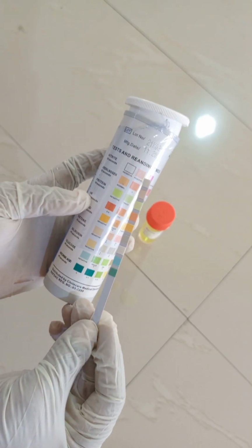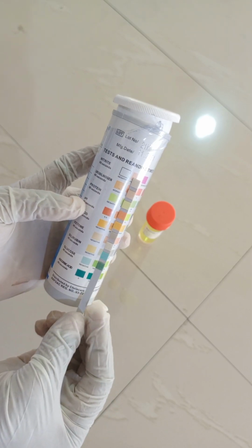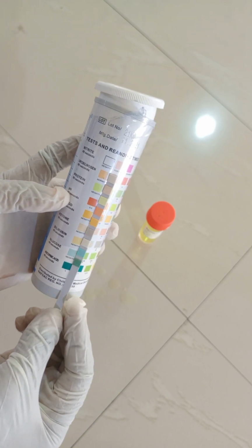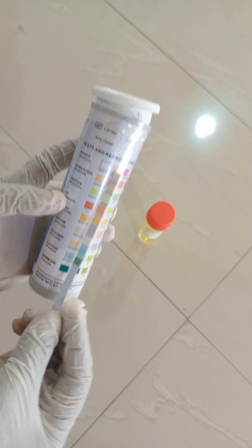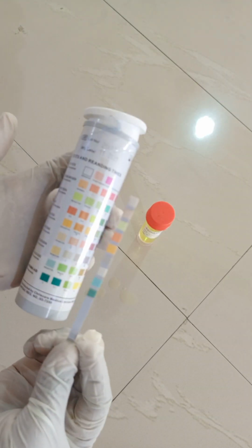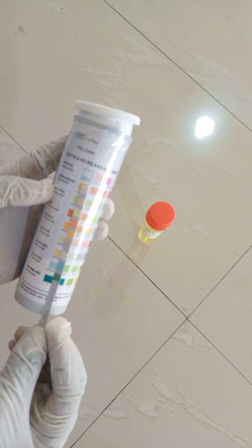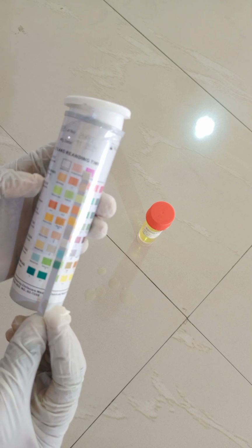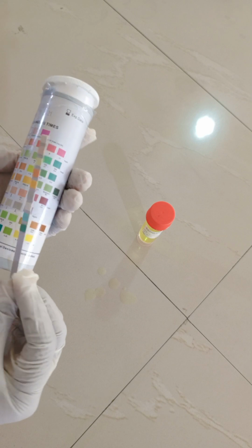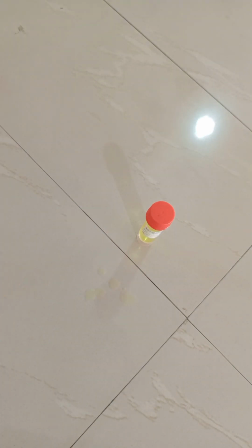You hold it by the part where there is no chemical, and if you match this strip with the first line, you see that it corresponds with the first line, right? And once that is ascertained, it means it's good, and then you can use it. And then when you dip it into the urine, all you do is to match and check the color that corresponds, if there's any color change. So it's about dip and match, dip and match. It's that simple. All right.